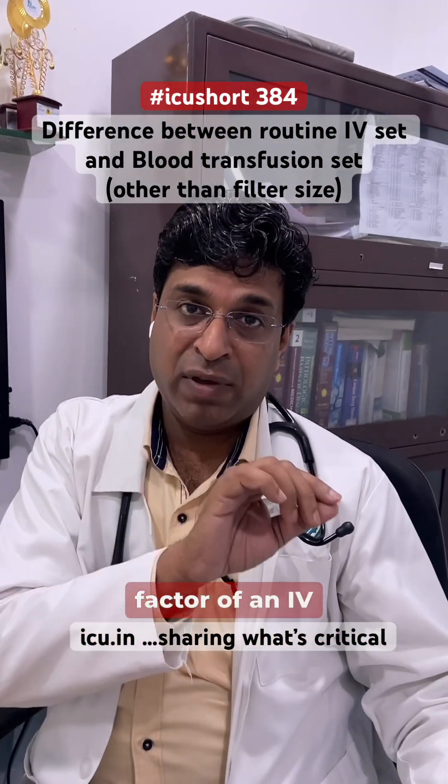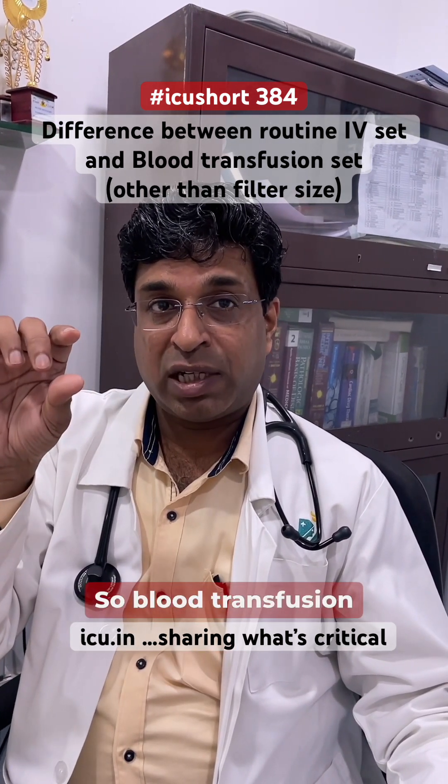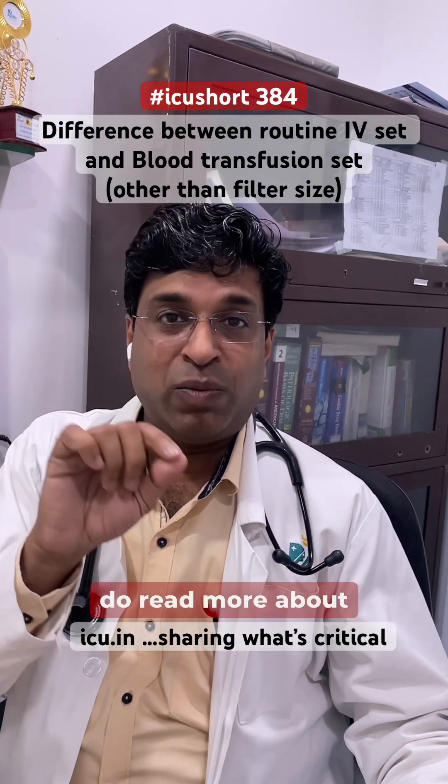This is the key difference between the drop factor of an IV infusion set and the blood transfusion set — the drop factor for blood is a little less. Do read more about it.